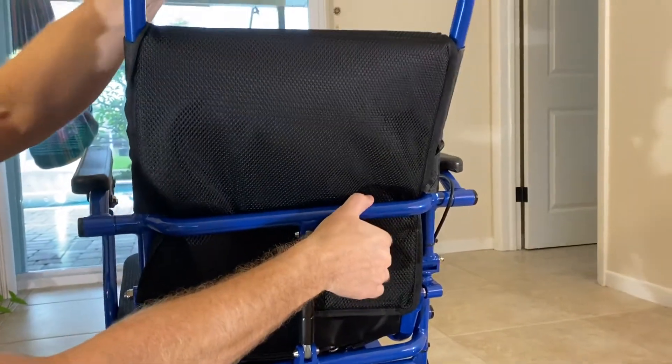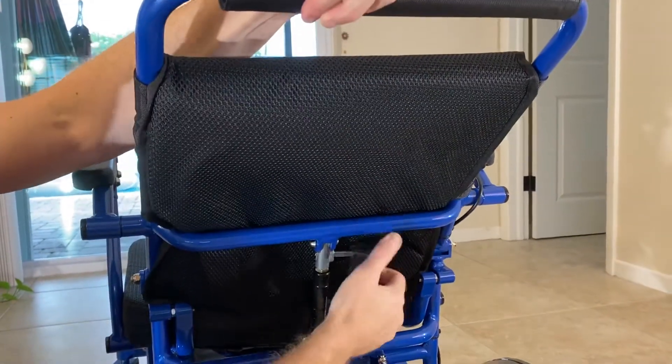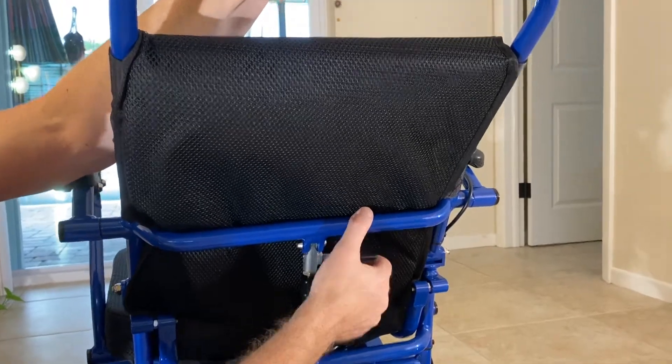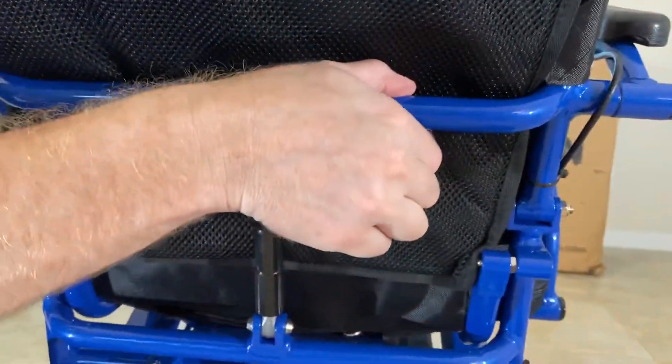If I lift up, it releases the pressure and I can bring the chair to an upright position. I'm just lifting the chair up, pulling it back. It's very easy to do and I can stop at any position that I want to get the best adjustment.